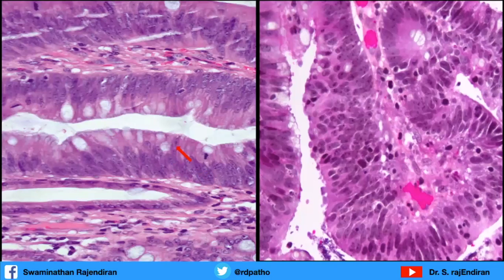See again here stratification has started, but you see mucin is less. I won't say lost, it is less. And these stratified nuclei reach the middle third. They are not touching the upper top of the apical membrane. They are reaching the middle third predominantly. Okay, that is one important point. And the other one is, look at these nuclei. They are all traveling in one direction. So the polarity is maintained. Okay, so those 2 points are very important. And the third one is no prominent nucleoli.